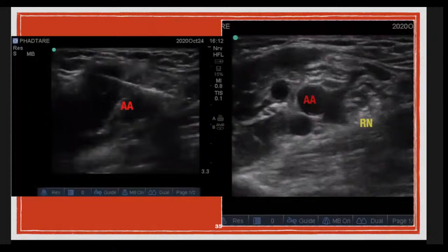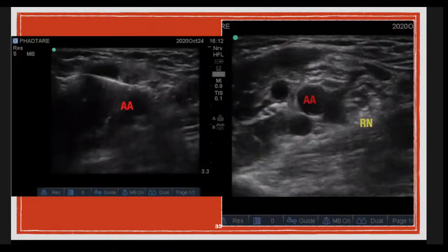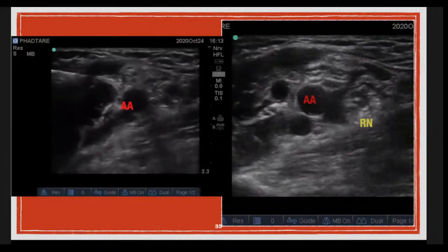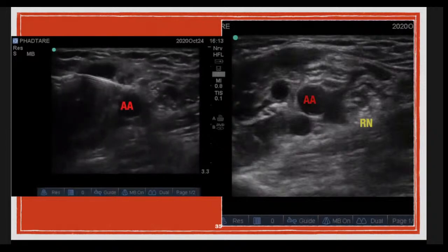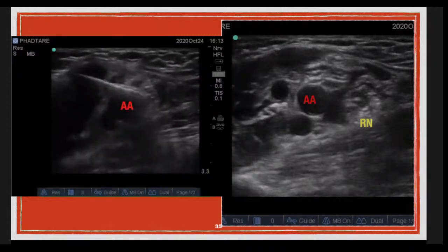So I want to show this video. We can see in the first picture, the video actually, that there is a very poor sonographic quality. So when just half ml of local anesthetic drug was injected, though there was no resistance to injection, we observed that the radial nerve seemed to have increased in size. In the second picture, we can see the radial nerve cross section, the diameter of the radial nerve has increased. So the moral of the story is that we should not inject drug until we get a good sonographic picture.